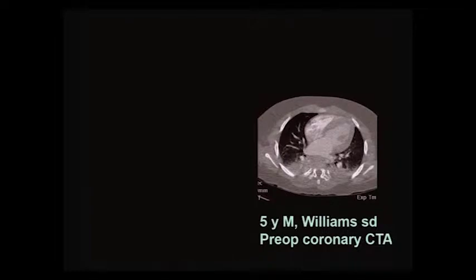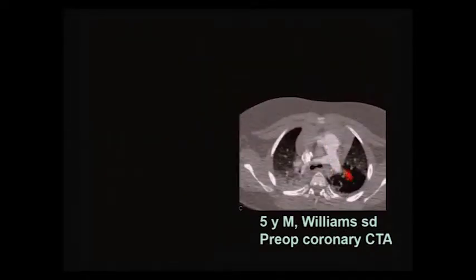And this patient underwent preoperatively a coronary CT angiography. The cardiac anesthesiologist who sedated the child had some difficulty intubating the patient. We see some atelectasis. And we see that the scan didn't come out that well. It's mainly opacification of the pulmonary arteries, but what we were most interested in was the coronary arteries that was kind of missed by the bolus timing technique.